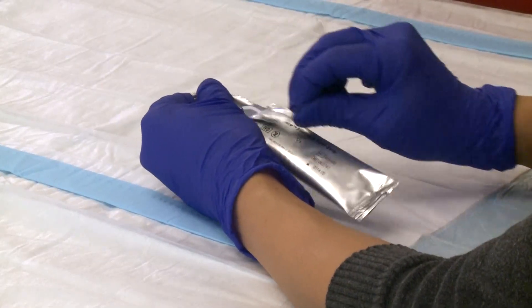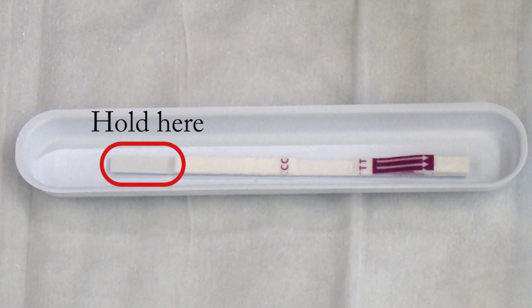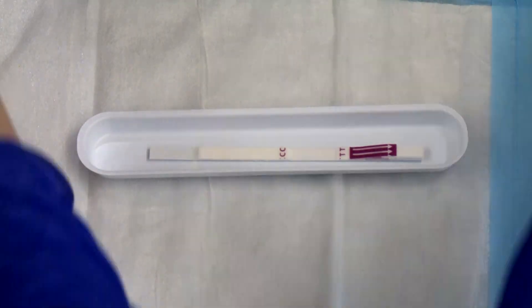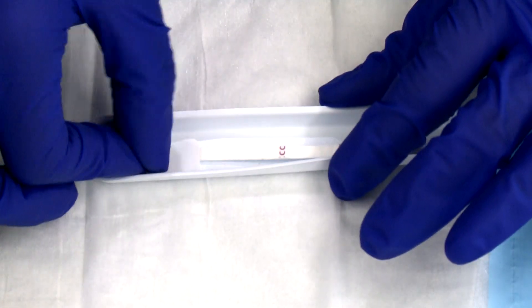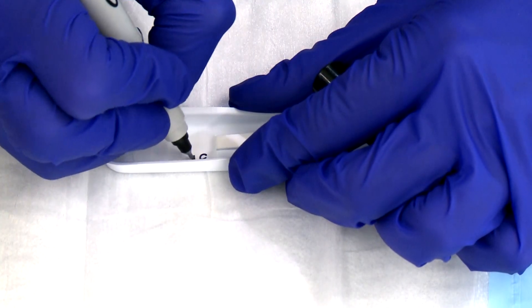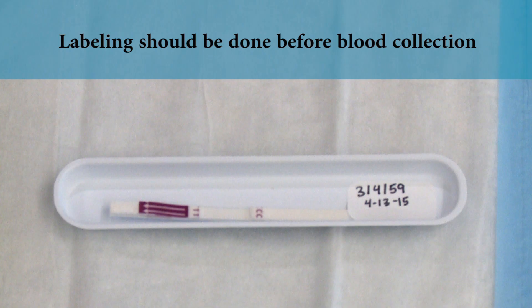When ready to perform a test, the strip and tray should carefully be removed from the foil pouch. If the strip needs to be handled directly, it should be held at the end without the arrows. Remove the desiccant packet from the tray and put it aside. The test strips are very lightweight; the labeled strip should be secured to the provided plastic tray to reduce the risk of blowing away. This can be done with the adhesive patient label or with tape. Each FTS should be labeled with an appropriate unique patient identifier using the provided sticker or alternative label. Labeling should be done before blood collection.